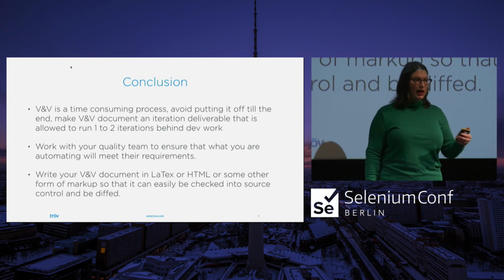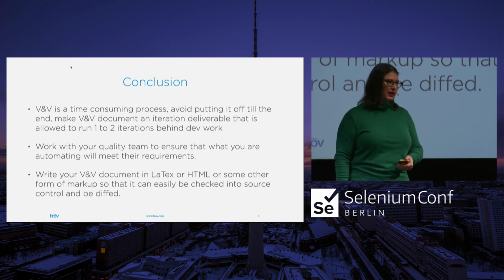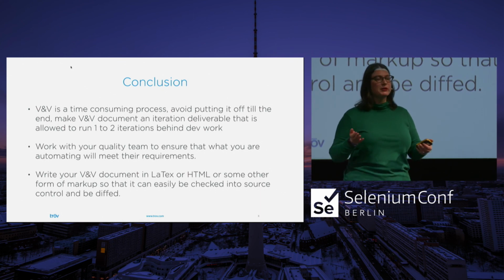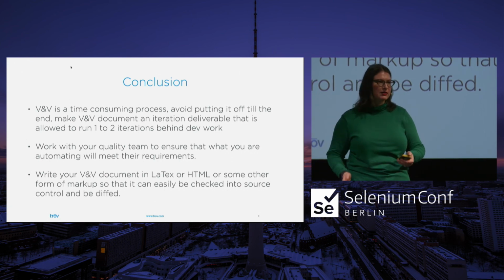And ideally, I would move the stories to an entirely different board that illustrated we did our initial checks, we're writing our automated tests, we've added everything to the V&V. Now the story is done. And it's not done until it's in the V&V. Because that is when that feature is complete, from my perspective. Which basically means it's almost an entirely different software project. You've handed somebody something, and then you've said, do your project and your process on it.